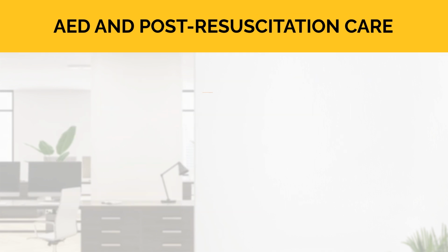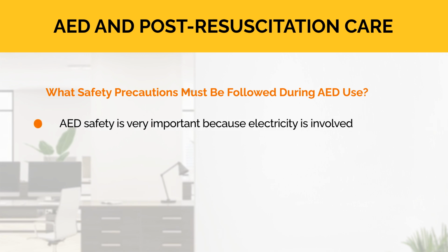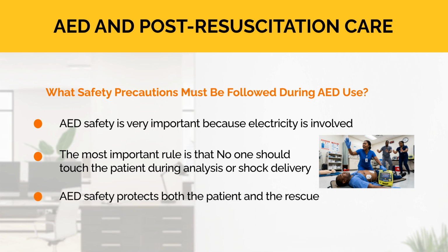Next, what safety precautions must be followed during AED use? AED safety is very important because electricity is involved. The most important rule is that no one should touch the patient during analysis or shock delivery. AED safety protects both the patient and the rescuer.